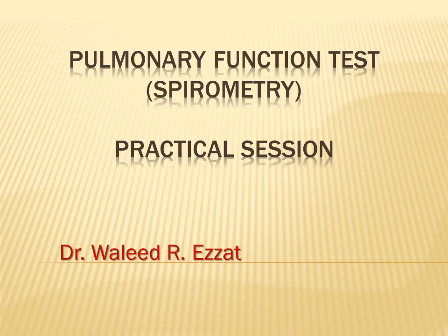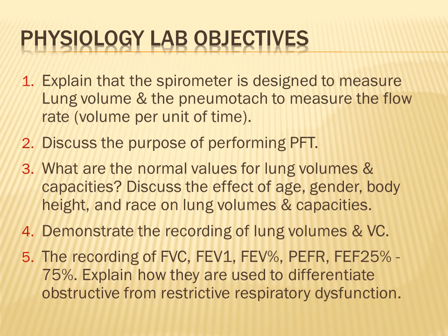I will try in this session to explain to you what spirometry is and what the clinical significance of applying spirometry in clinical practice is. The objective of this physiological lab session is first to explain that the spirometer is designed to measure lung volumes and to measure the flow rate, thus to say the volume per unit time.